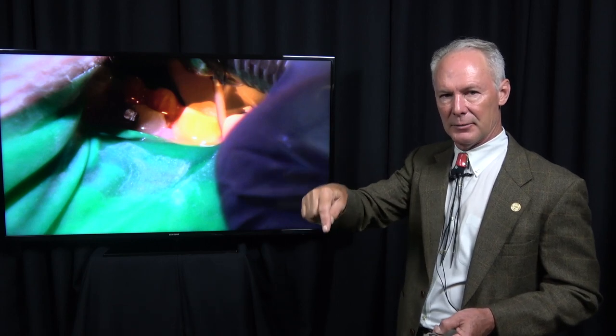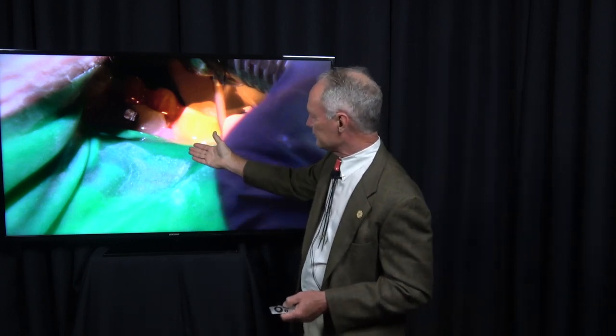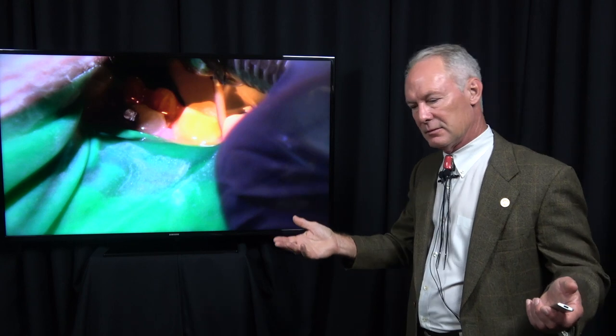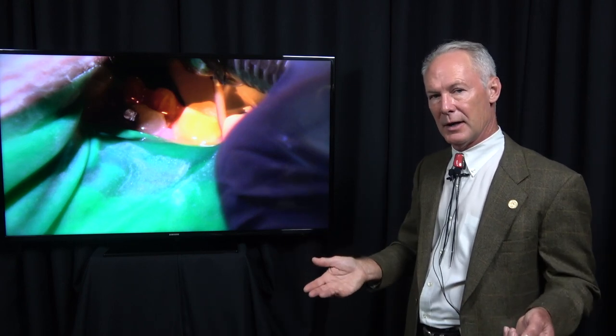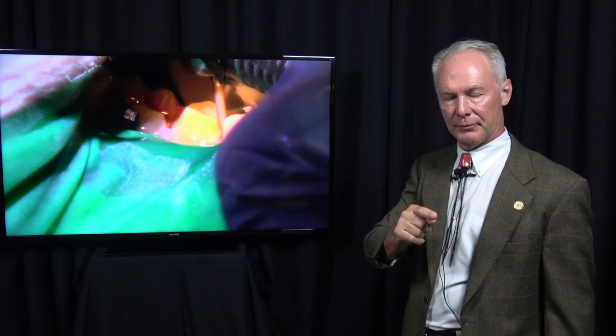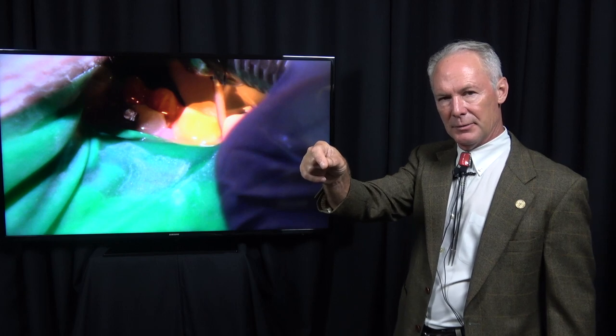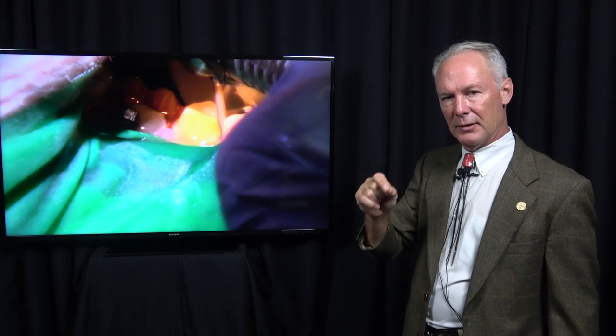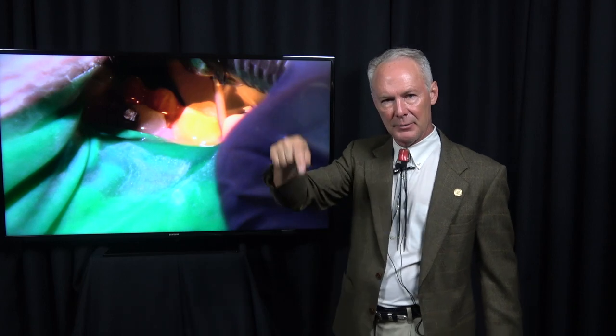Keep it about a half millimeter interproximally. On the facial, I may prep a millimeter subgingival, or even a millimeter and a half, because the sulcus is a little bit deeper, and it's easier to remove the cement. You don't ever want to prep past the bottom, the most apical part of the sulcus. Ideally, you don't want to prep more than about halfway into the sulcus, but hardly ever more than about half a millimeter interproximally.